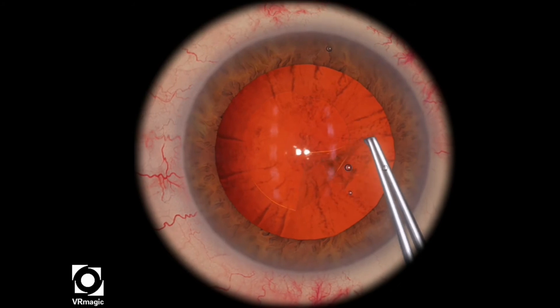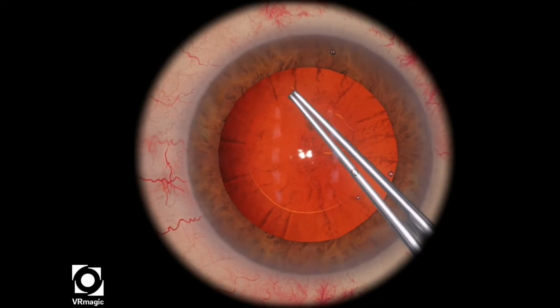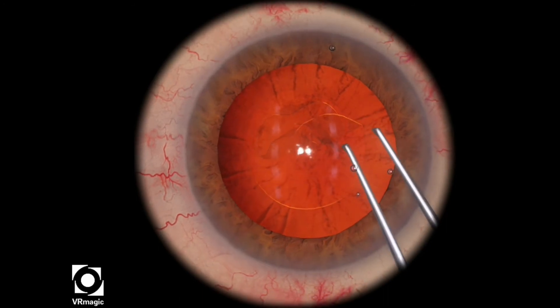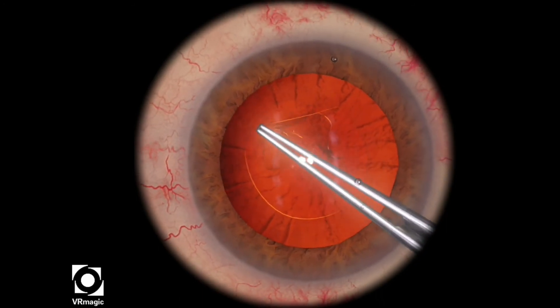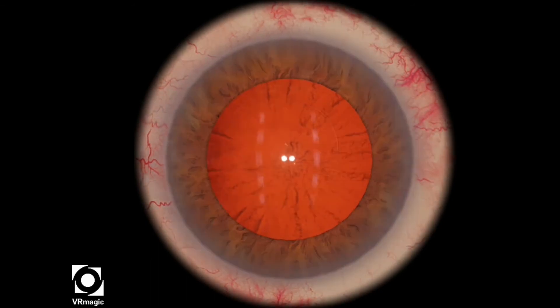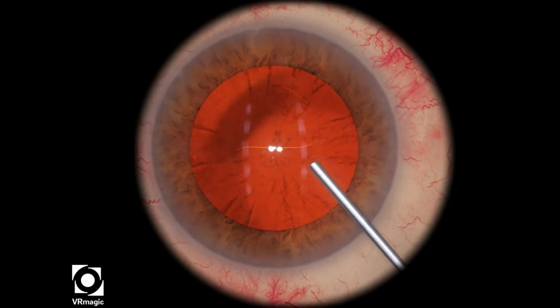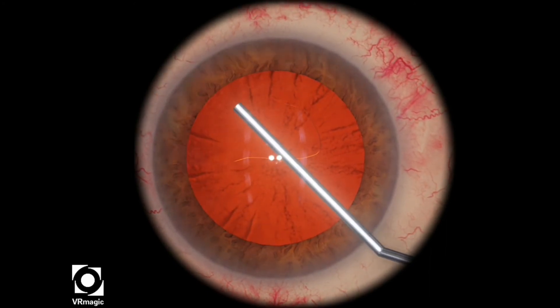Here I'm using a shearing technique and trying to make the Capsulorhexis as round as possible. I make it almost the same size as where the tear had run out a little bit. You can tell at the very end that the Capsulorhexis is still quite round, a little bit larger than normal, but that's the price you pay when the rhexis runs out a little bit.